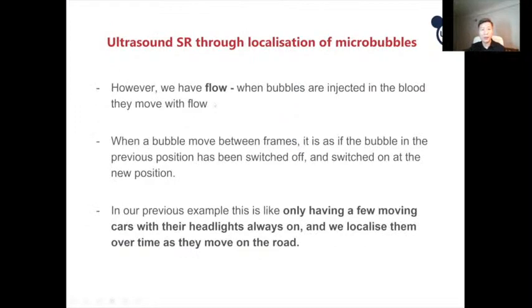However, we have flow. In the blood vessel, the blood flows. So when bubbles are injected in the blood, they move with the blood flow. And when a bubble moves between frames, and this is quite a key point, it is as if the bubble in the previous position has been switched off and switched on at a new position.